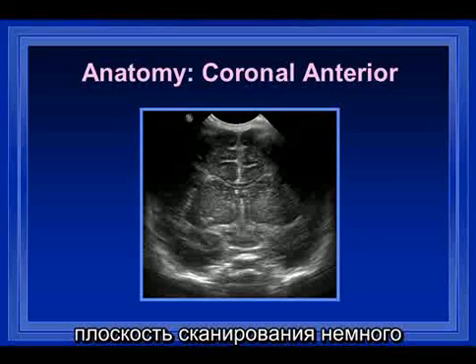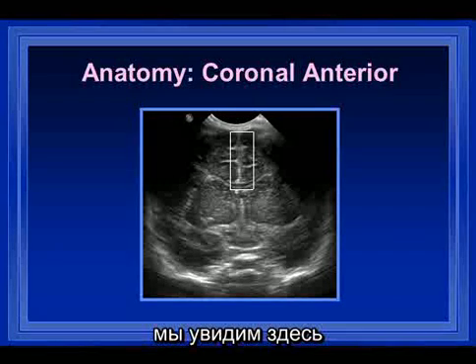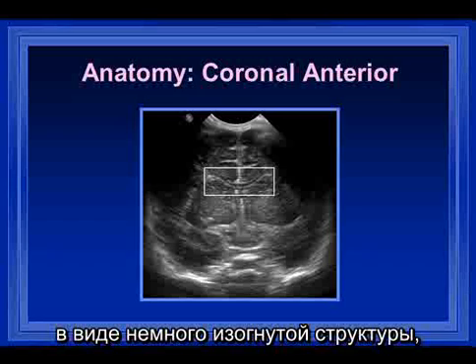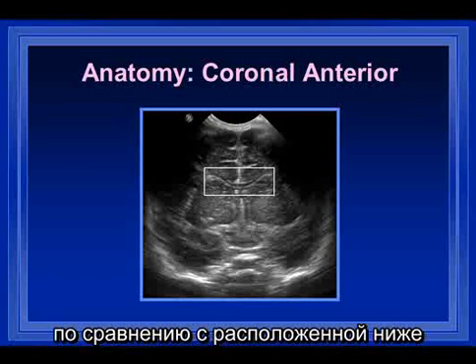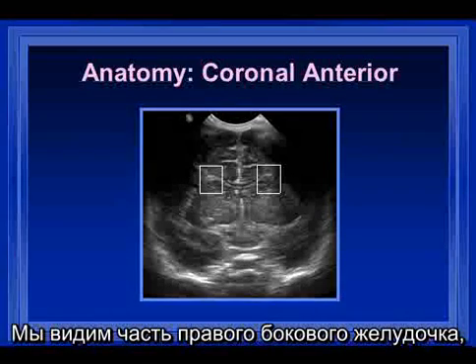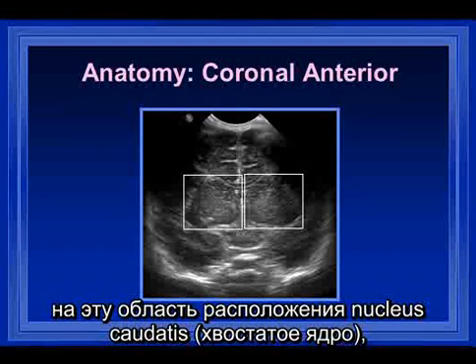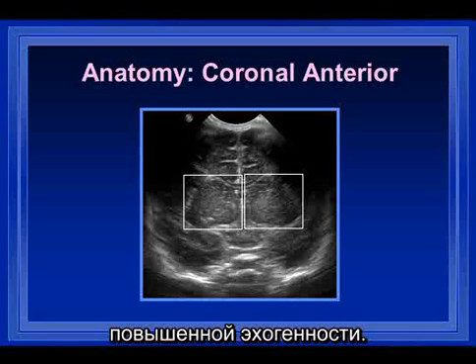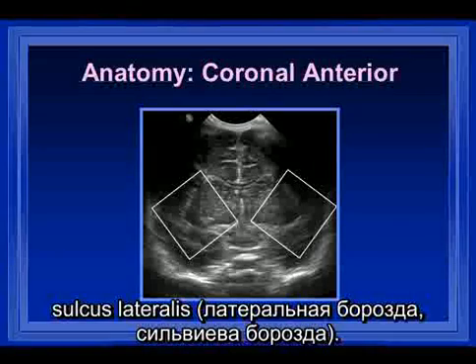Extending the view a little bit more posteriorly but still in the anterior plane, we see the interhemispheric fissure and the cingulate gyrus. The corpus callosum appears as a hammock-shaped, poorly echogenic structure just below the frontal lobe parenchyma. We have portions of the right and left lateral ventricles, and we are beginning to see the caudate nuclei bilaterally as slightly brighter areas of increased echogenicity. We are also beginning to see the Y-shaped structures representing the sylvian fissures.